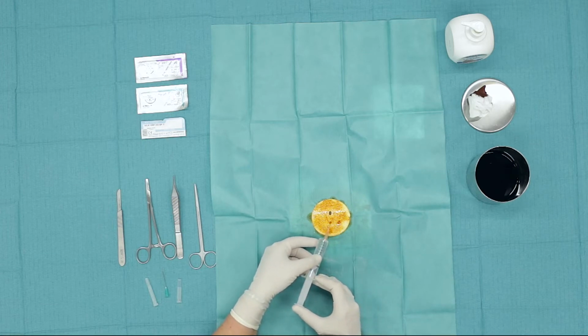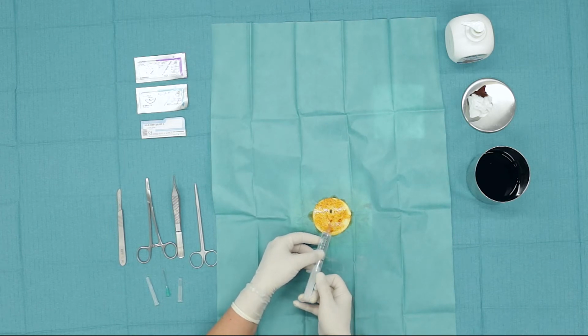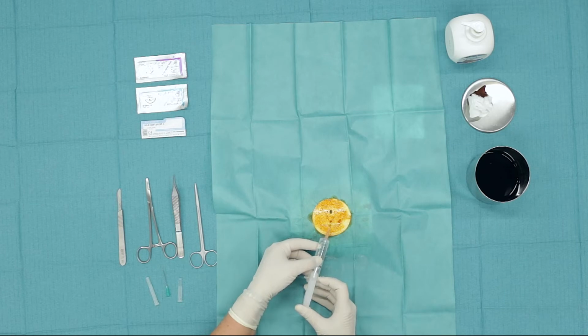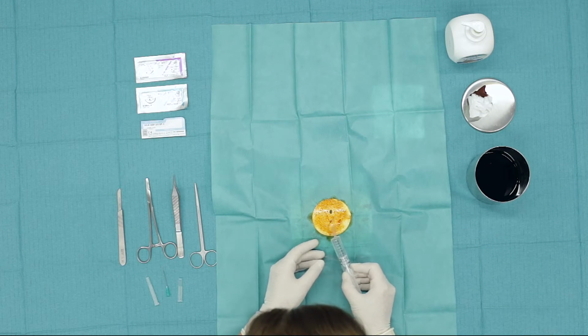Then, on the other side, again in the same way, suction and gradual administration of the drug by withdrawing the needle, in order to avoid multiple piercings of the patient's skin. In this way, the anesthesia that has been achieved concerns this and this length of the incision.